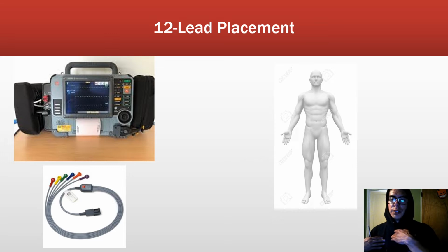So you'll be able to feel down, there's a rib, feel to the next space, then work your way down. You're going to go to the 4th intercostal space. So collarbone along the sternum, 1, 2, 3, 4. So it'd be right there, and it goes 4th intercostal space right to the right side of the sternum, so to the right of the sternal border.